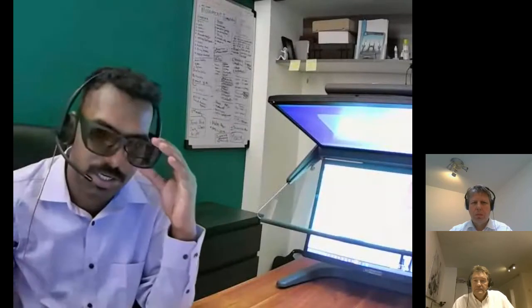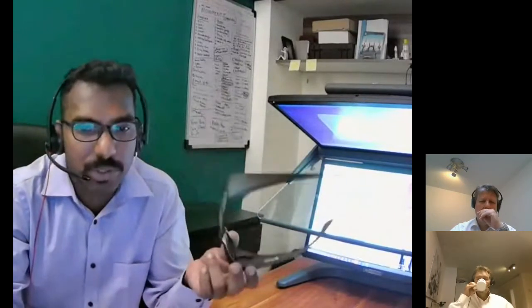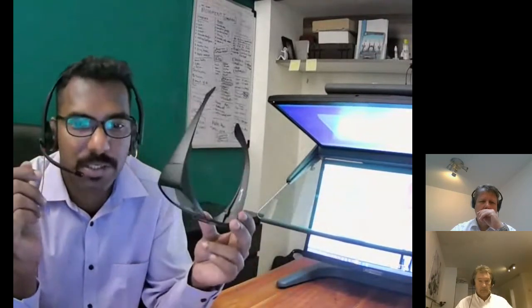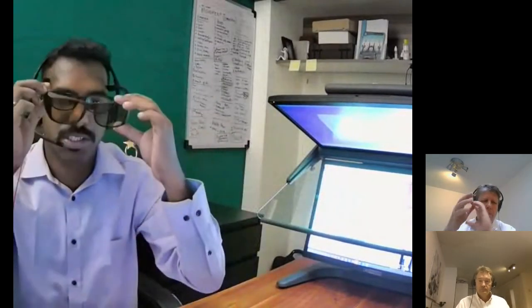So I was just using our 3D PluraView while you were presenting. And this is the glass which I was talking about to a couple of people before. These are such light glasses, and I'm also already wearing glasses. So most probably you'll have so many disturbances if you have prescription glasses, then if you want to put 3D glasses on, you can see how thin it is. There is no battery over here.